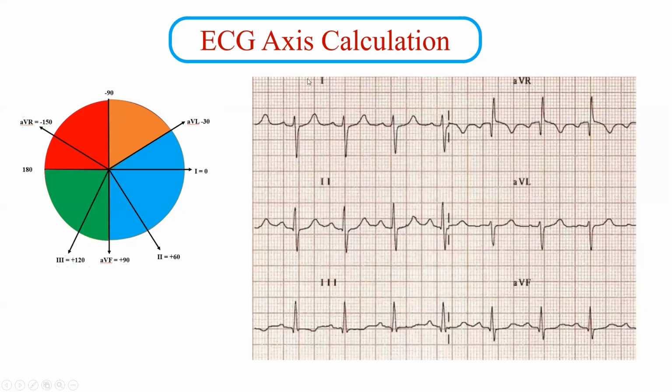Okay, let's talk about this EKG here, all right? What we have here? All right, let's look at the isoelectric line. The isoelectric line for me, I believe this is lead 2. Look at lead 2. This is the most isoelectric line I can see, because the positive deflection is equal to the negative deflection. Okay, lead 2 is perpendicular to AVL.